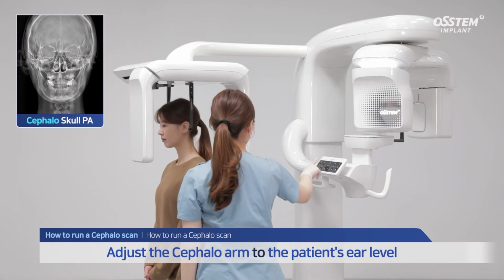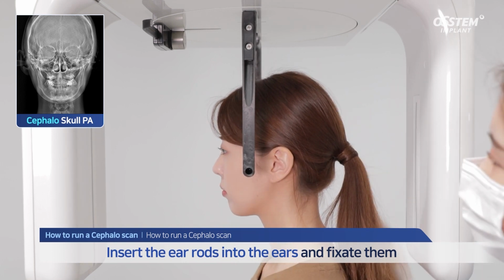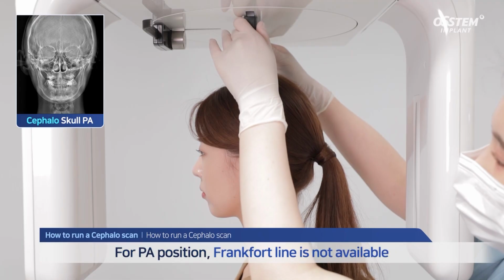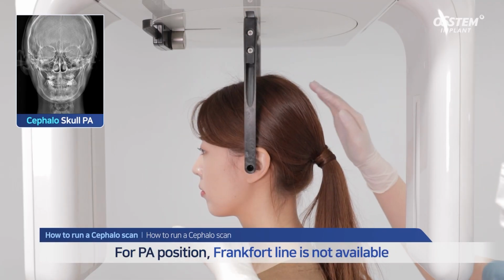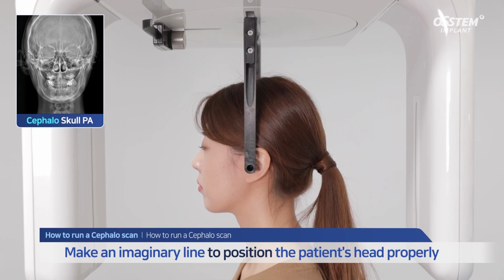Adjust the cephalo arm to the patient's ear level. Insert both the ear rods into their ears and fixate them. For PA position, the Frankfort line is not available. Make an imaginary line to position the patient's head properly.